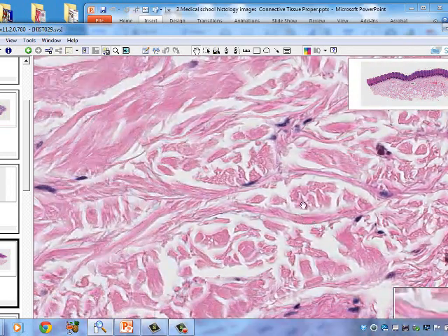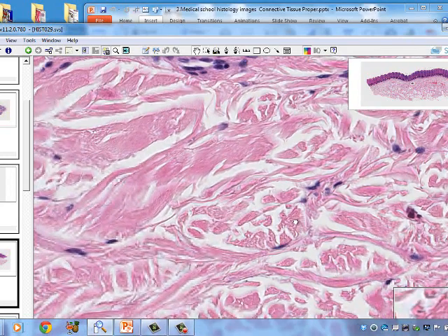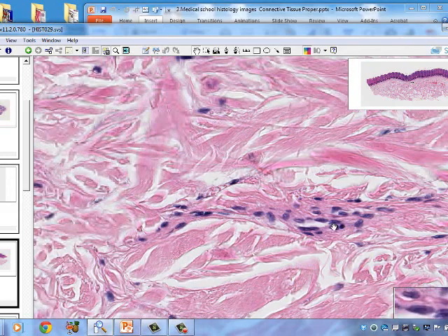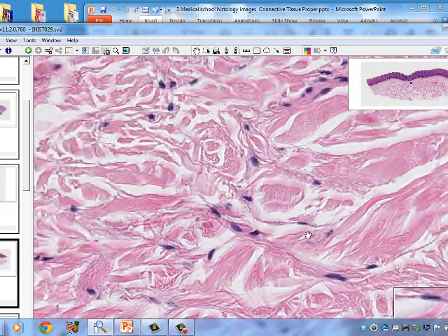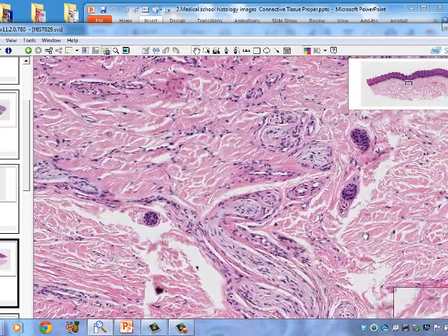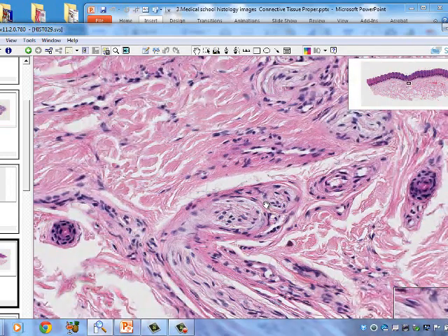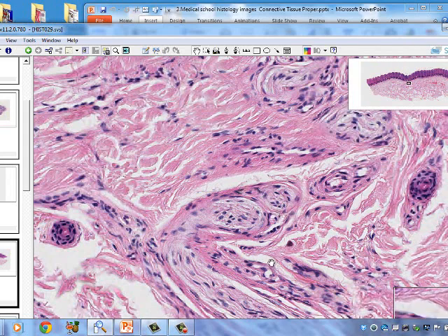Some collagen fibers appear in cross-section, others in longitudinal section — but these are clearly bundles of collagen fibers. A blood vessel is visible with endothelial cells and smooth muscle cells on the outside. A nerve is also present, with connective tissue — the perineurium — on the outside composed of fibroblasts.